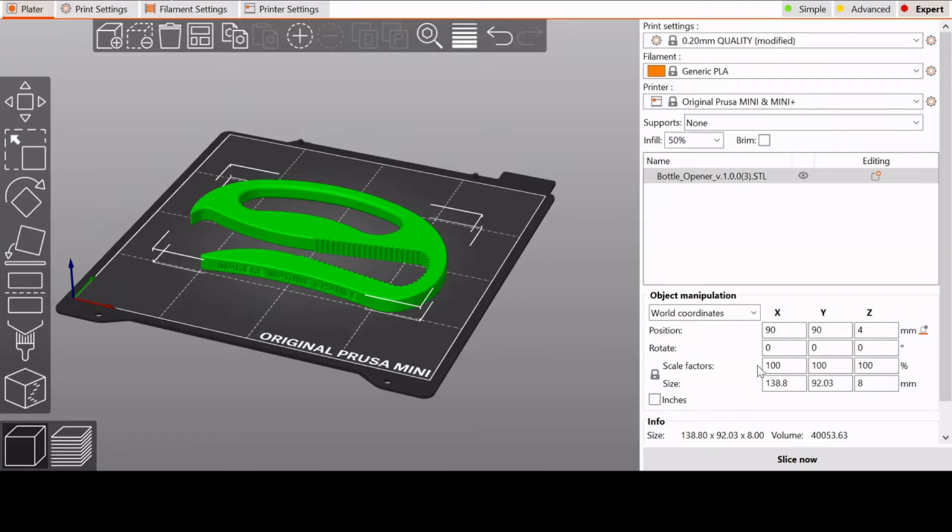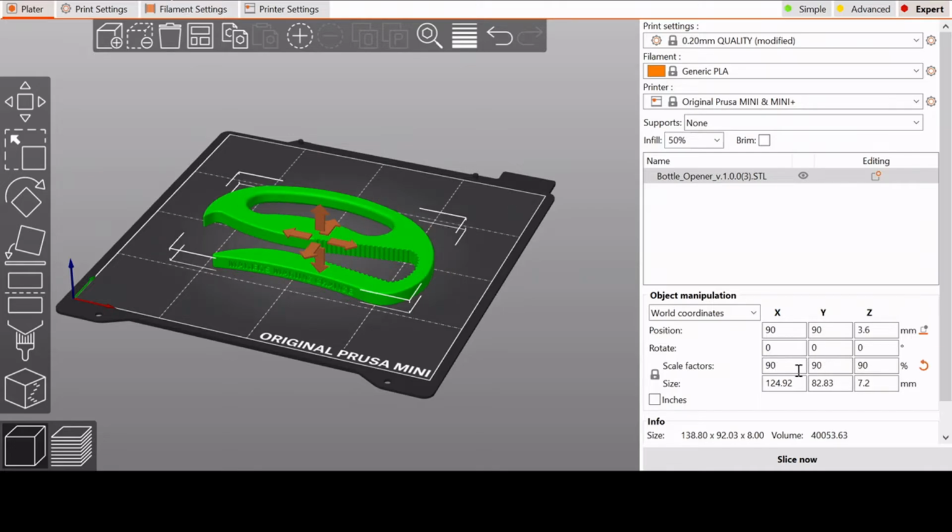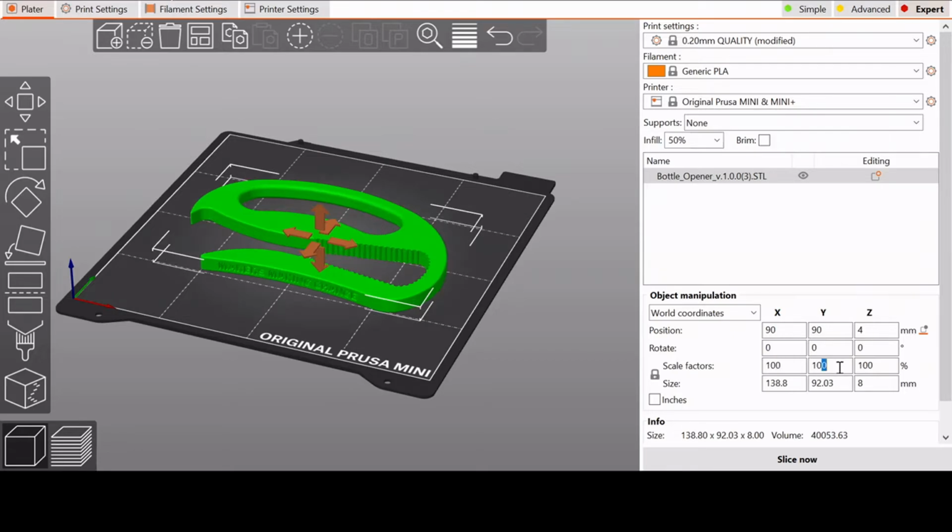Another real quick consideration is that you can actually change the size of the object that you're printing in the slicer itself. So if you come over here and click on this setting right here, it'll be in different locations depending on the slicer that you use. It's typically called a scale tab. So you can adjust your size here, and just be mindful if you want to change one setting or if you want to change the entire object all at once, you can click on this little lock button to do that.